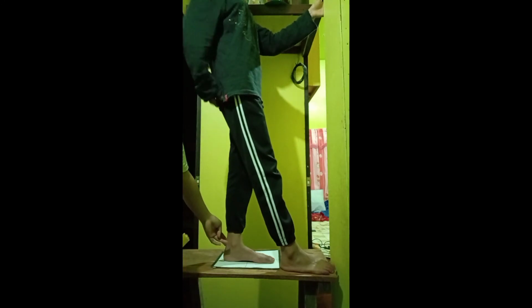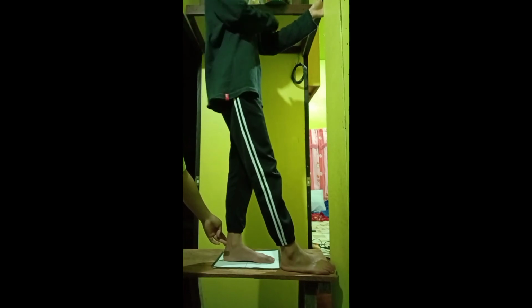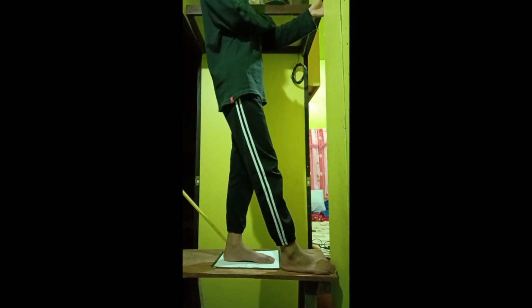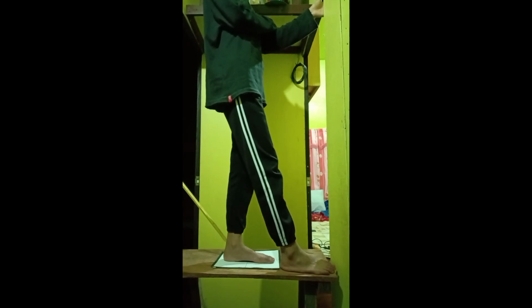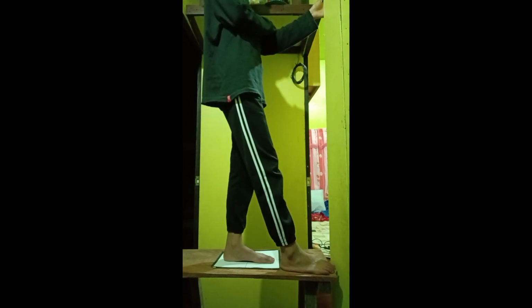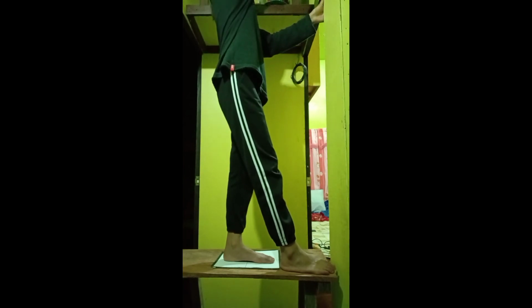The central ray is at the back of the patient entering the posterior aspect of the patient ankle with the angulation of 25 degrees anteriorly. Dito siya mag-enter. This projection demonstrates all bones of the foot free of the leg.